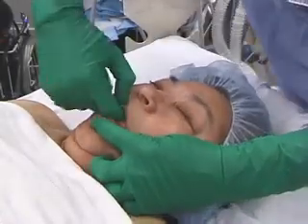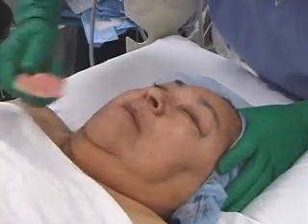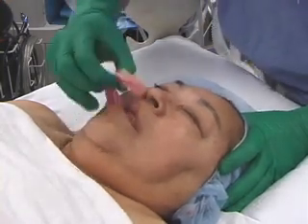Before beginning face mask ventilation, it is prudent to examine the patient's oral cavity when possible. Smaller dental prosthesis or other foreign bodies can be swallowed or aspirated. One may consider leaving full dentures in place to provide a better mask seal.